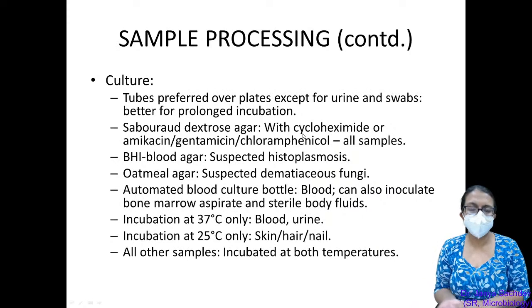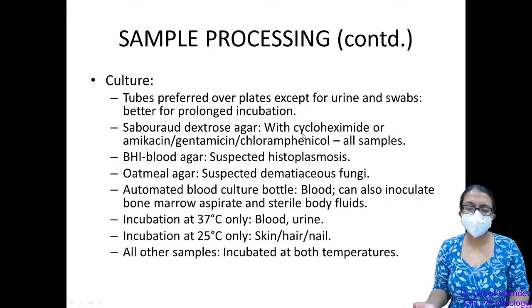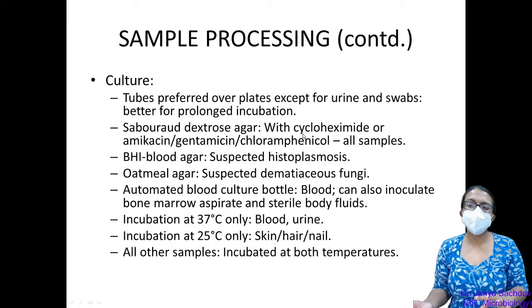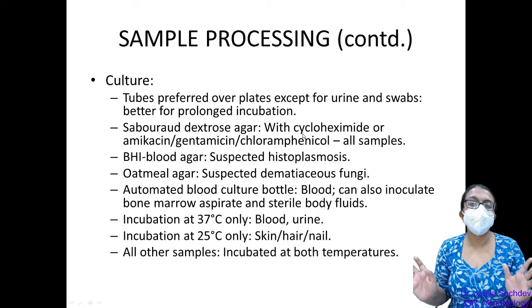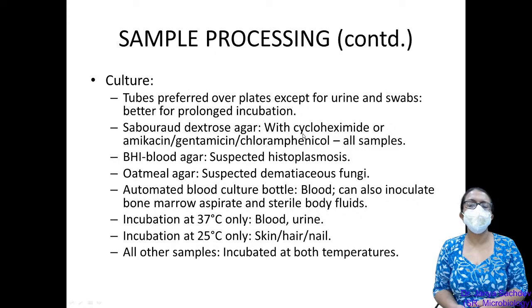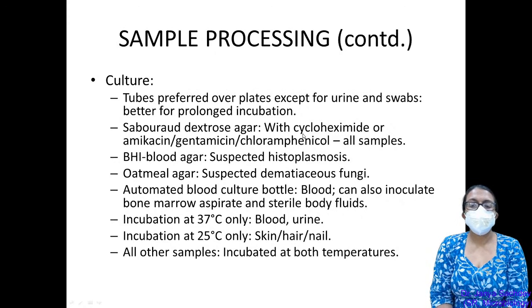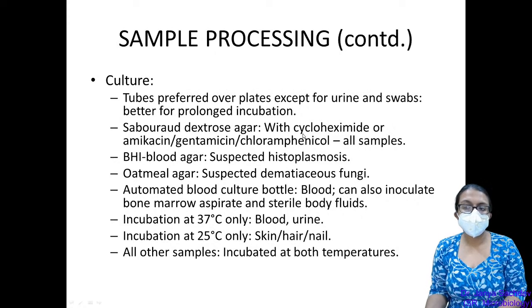treatment. However, the limitation of direct microscopy is that its sensitivity may not be very good. It all depends on the quality of the sample and the way the sample is processed. The sensitivity is not 100%. It would probably be in the range of about 60 to 70% for direct microscopy, depending on the technique being used. So just because the direct microscopy is completely negative, it may still come up in culture.